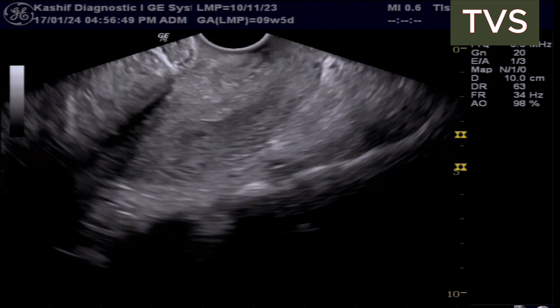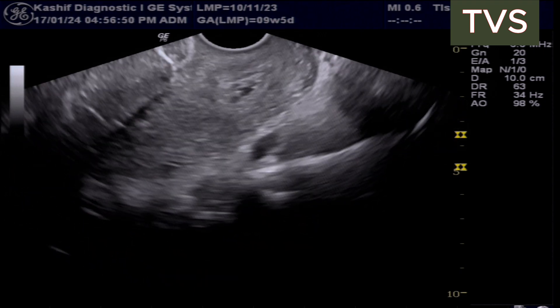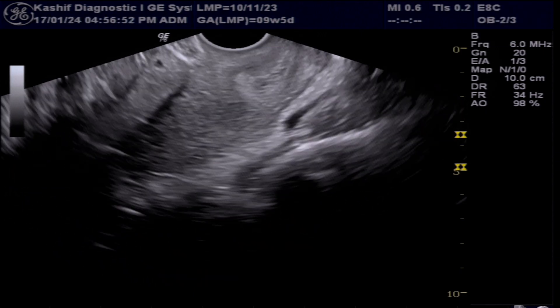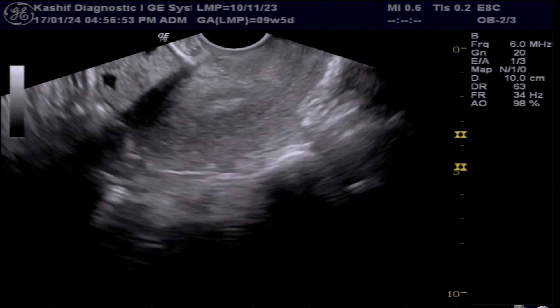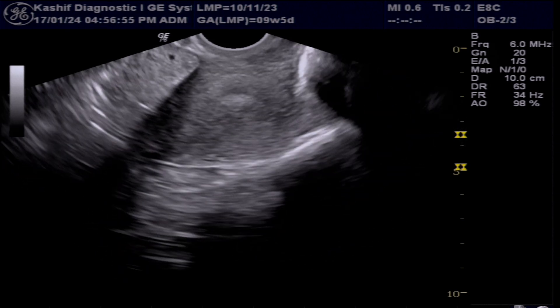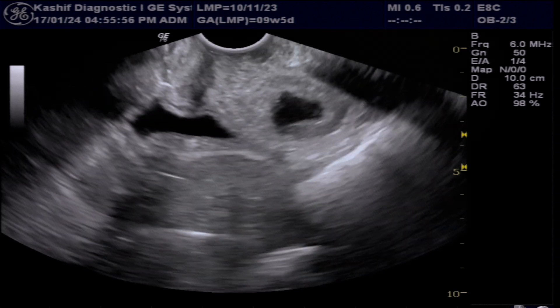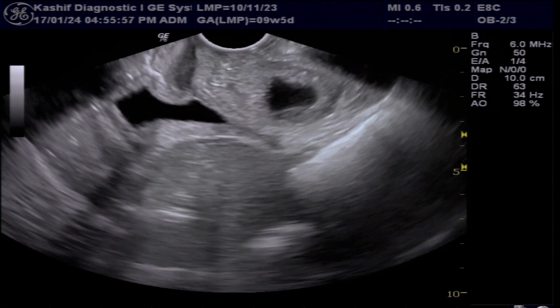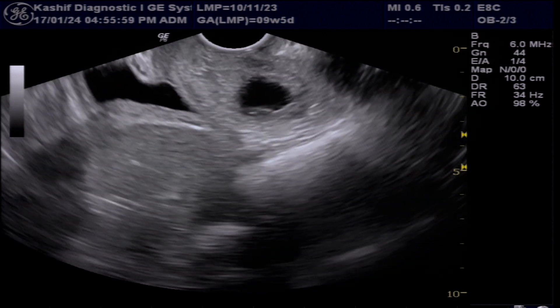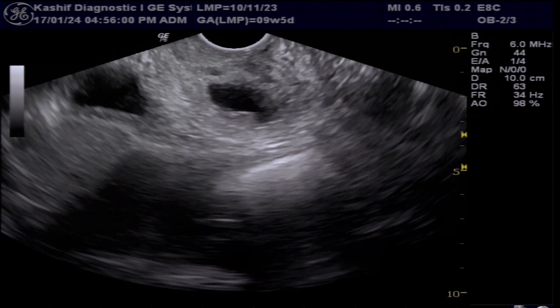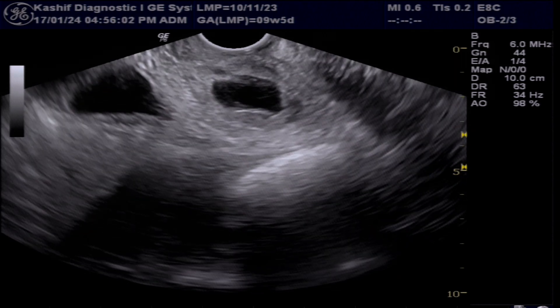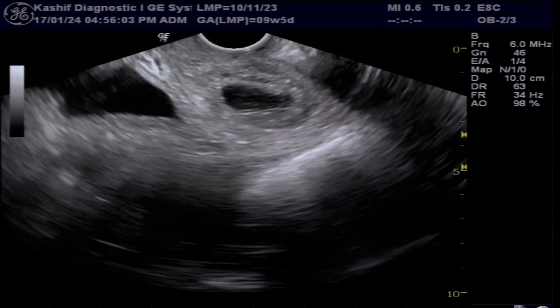So this is the case of miscarriage with the gestational sac in the upper vaginal cavity. From the vagina, this will be spontaneously evacuated with bleeding, and there is no need for D&C or any other procedure.